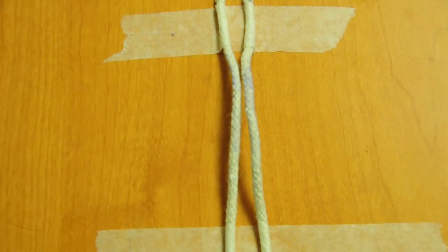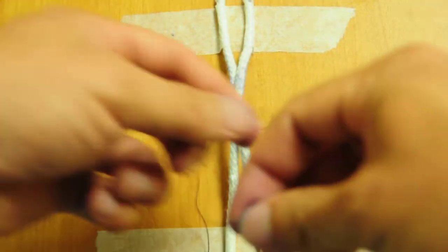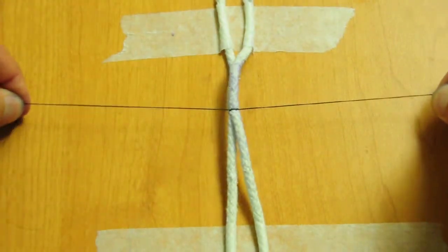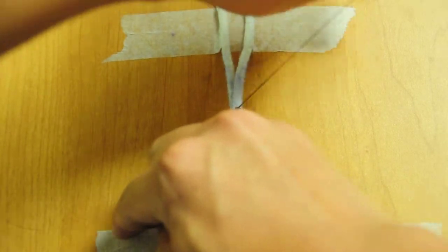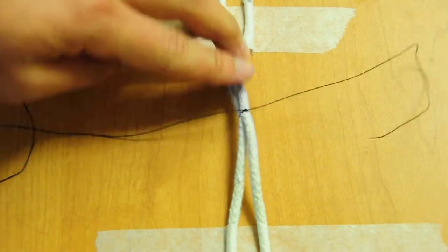So, one more time, real quickly. These are left-handed, two-handed ties, index finger, thumb, cross, index finger, thumb. All right, again, laying nice and flat across.